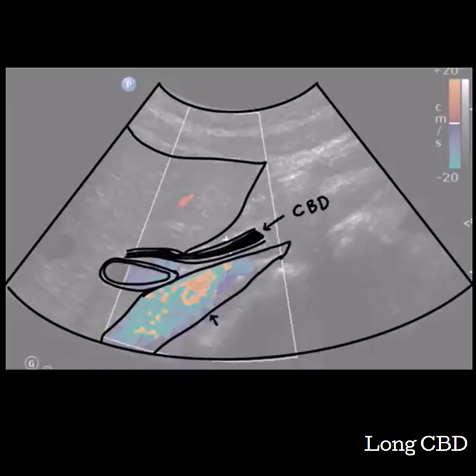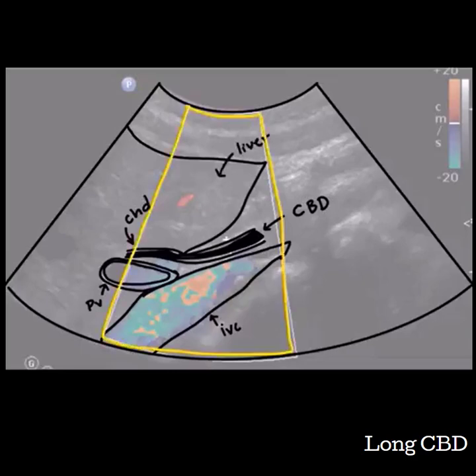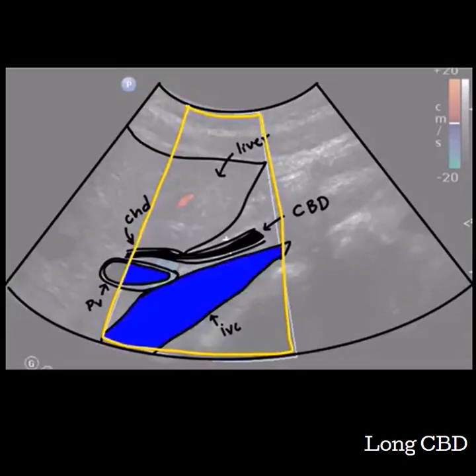Try having your patient take a deep breath in to steady the area. Zooming in on this area will also help to better visualize and measure these small structures. Turn the color on for your image and take an image with and without measurements. Make sure that when you do take measurements, you are measuring from inner to inner wall.